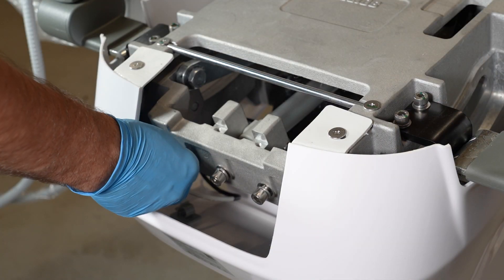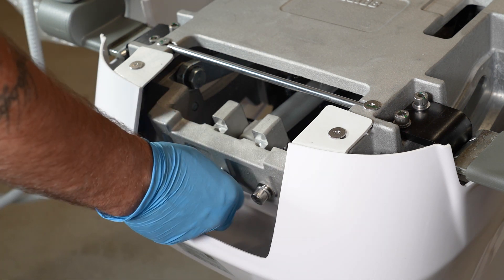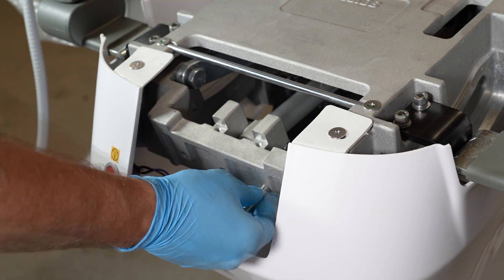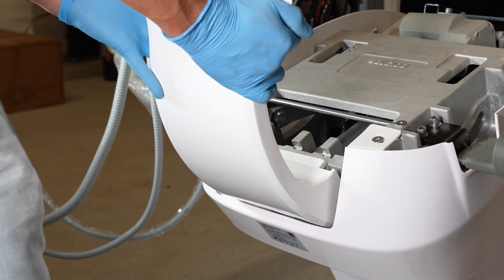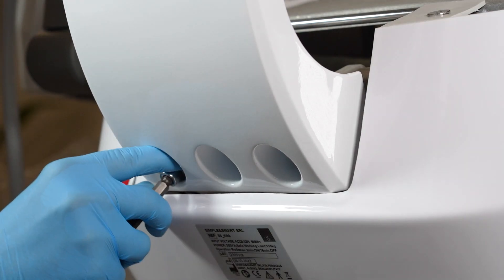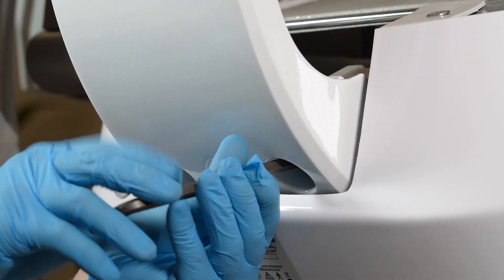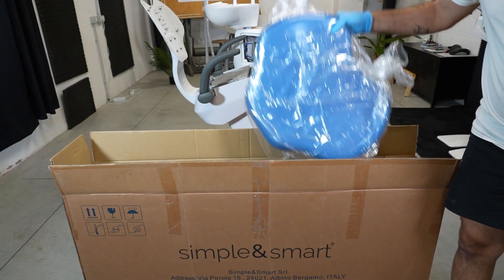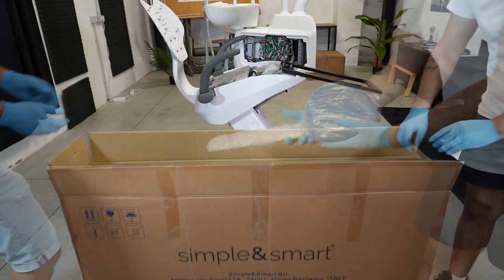Remove the screws from the frame. Place and fix the backrest on the seat. In the seat box there are the backrest leather, the headrest, and the seat.